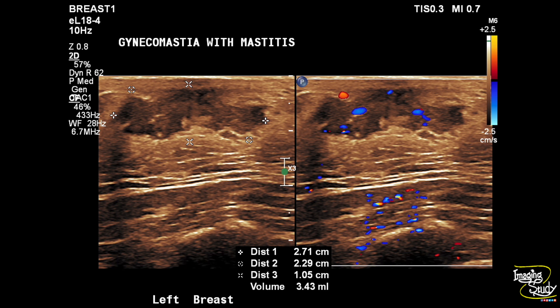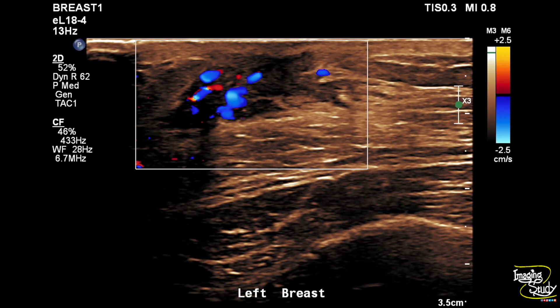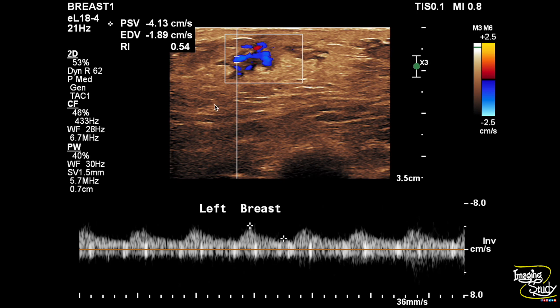We have tried to measure the volume of the proliferated mammary tissue. Here again the color Doppler picture shows increased vascularity indicating the inflammatory process. We checked the sample from the vessel supplying the lesion and it shows moderate to low resistant flow, further indicating the inflammatory process.